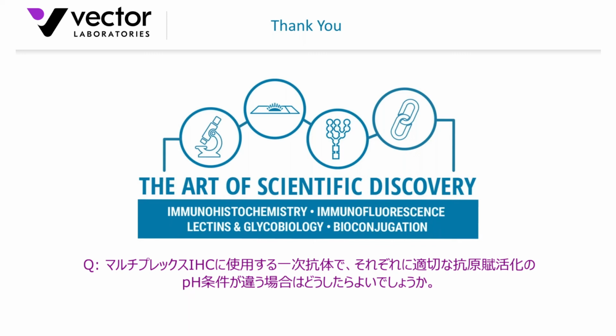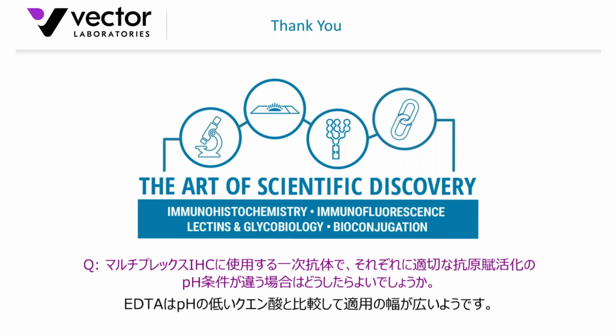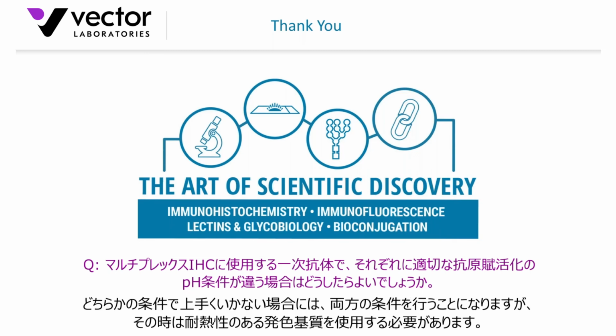unmasking reagent. So there's a couple of ways you can look at this. Number one, you can try both of those with the high pH. The EDTA seems to be, again, as I said, just repeating myself, more of a universal unmasking salt than the citrate or the citric acid at a lower pH. Try that, see if it works for both antigens. If it doesn't, then certainly you could apply either one first.